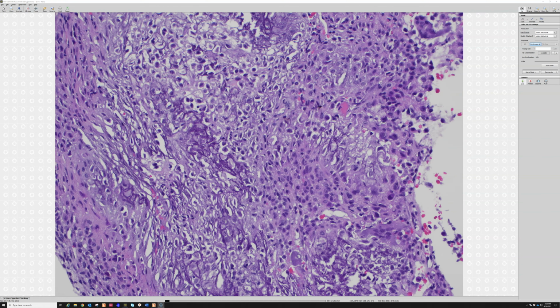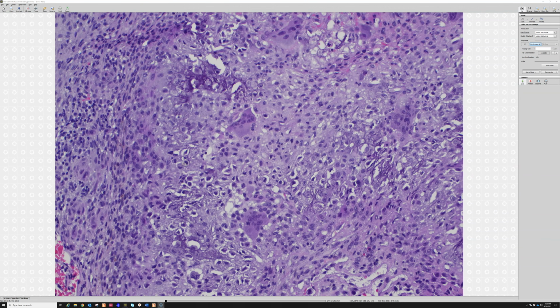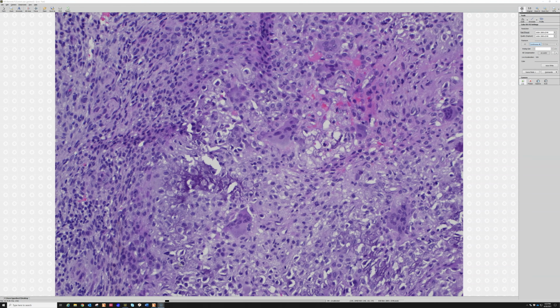Now, that's all very loose interpretation of radiology from me, a non-radiologist. So if you're a radiologist watching this and I misspoke, please forgive me and correct me in the comment section, because obviously radiology is much, much more nuanced than I begin to understand, even as a bone and soft tissue pathologist. But that's a really nice chicken wire calcification.